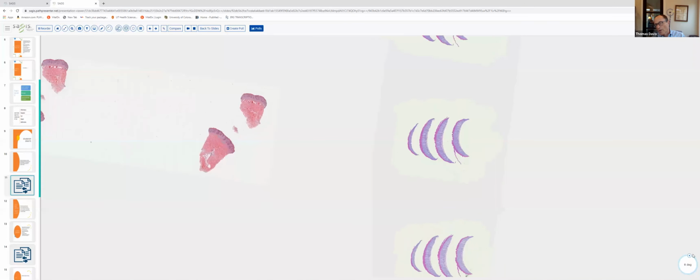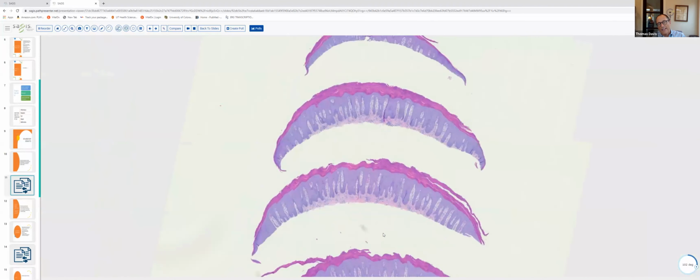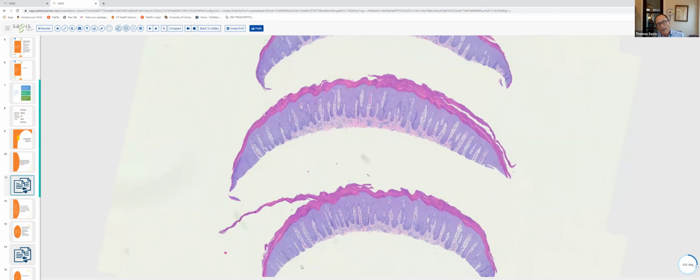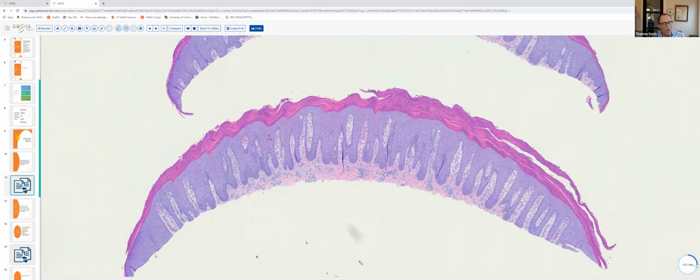In this case, we're going to be looking at psoriasis, which is our prototypical or gold standard condition demonstrating epidermal hyperplasia. Now, this is a shave biopsy, and when we've got a superficial shave like this, determination of anatomic site becomes a little bit more difficult. The pattern of epidermal hyperplasia here is a little bit different as well too.